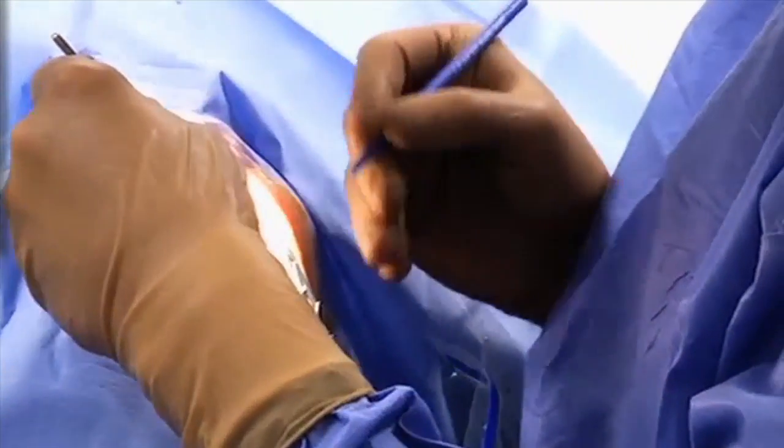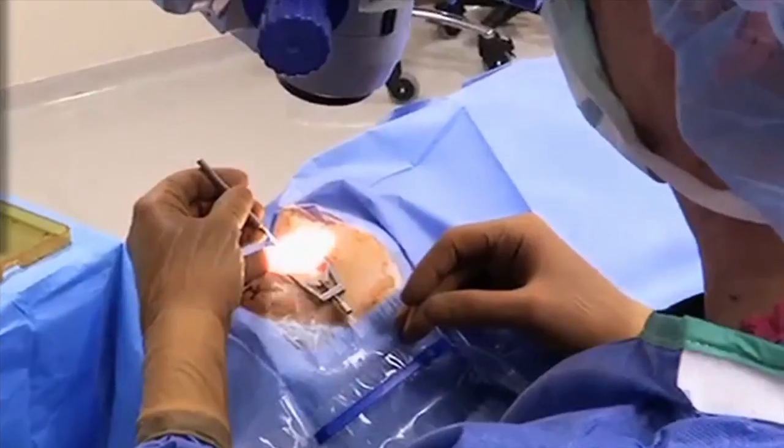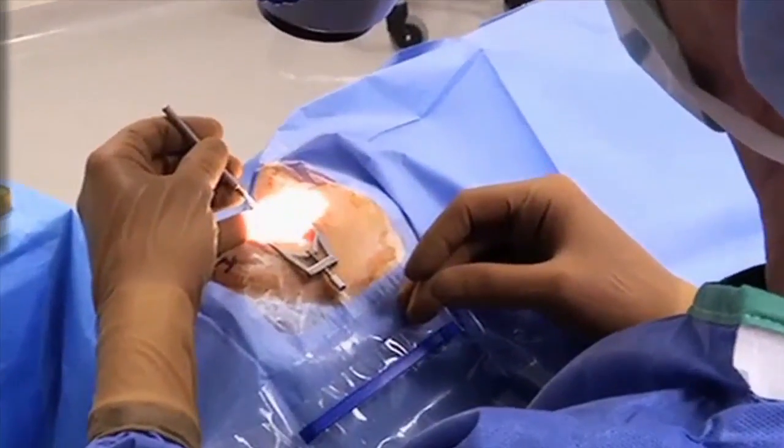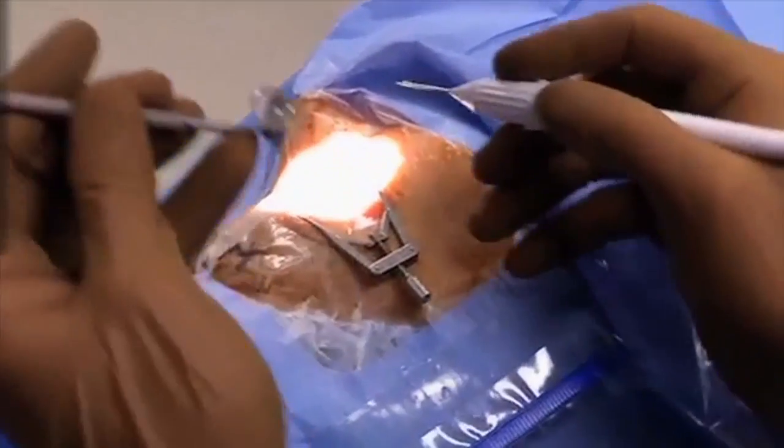I was surprised that after doing maybe 30, 40 trabectomes, I kind of sat back and I said, finally, I think I get it. Even though it seems simple, there is a learning curve that we don't maybe realize there is, and it just takes more experience, because only with time are you going to really feel what you're doing. It's not only visual, but it's also tactile. You actually begin to feel what you're doing.